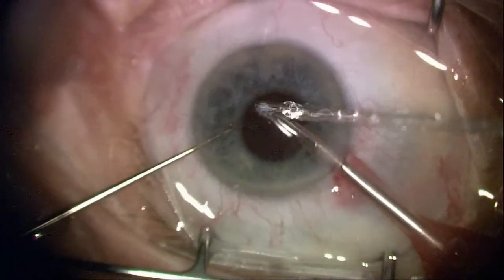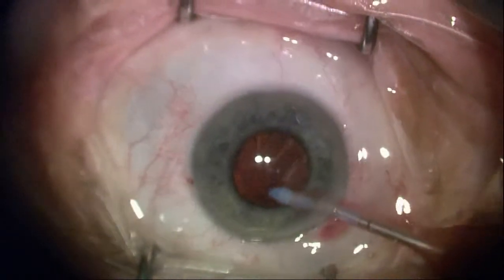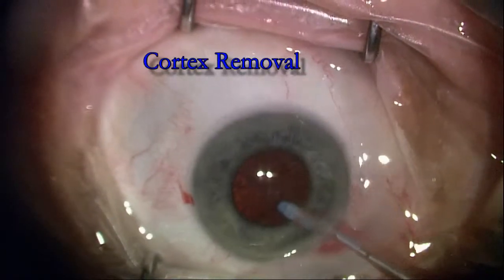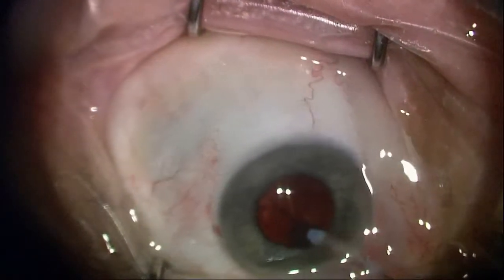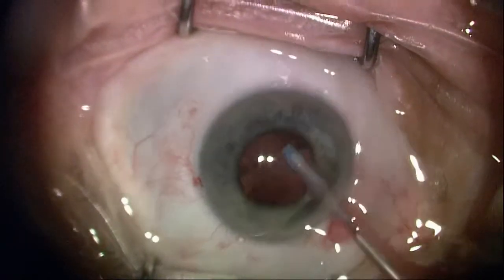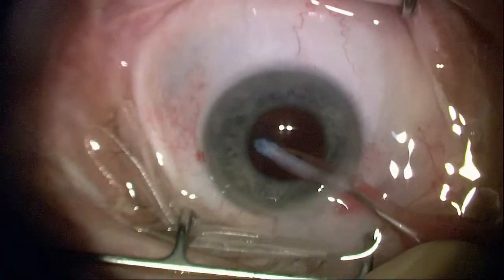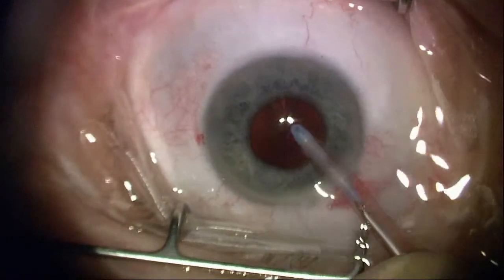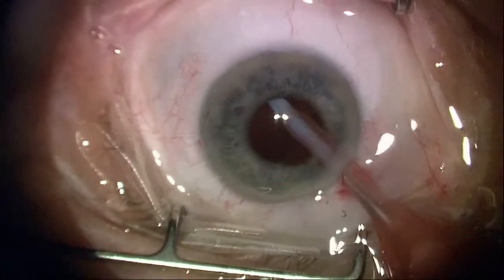This patient got over twice as much dilation medication as we would normally give. What I've set up here is the residual cortex. Very important: if you're going to use a straight IA tip, go ahead and remove the sub-incisional cortex first. And that's what I'm doing here, working my way around from that sub-incisional cortex and removing it meticulously. I'm going to check and make sure I don't have any residual cortex in the capsular fornix.